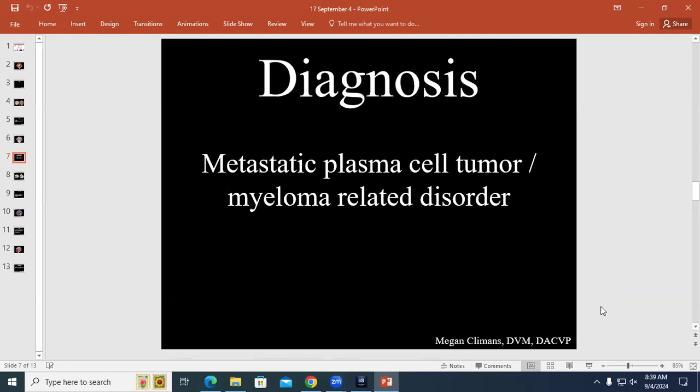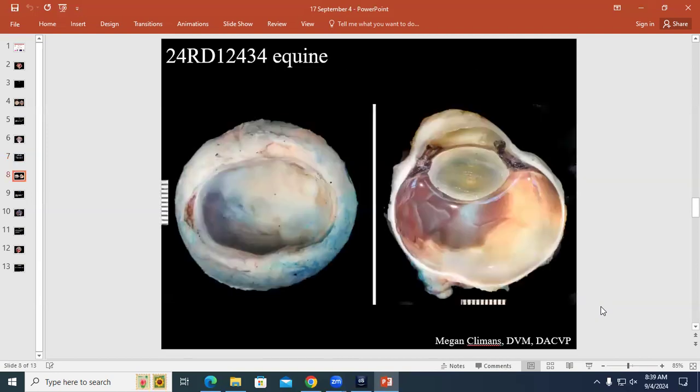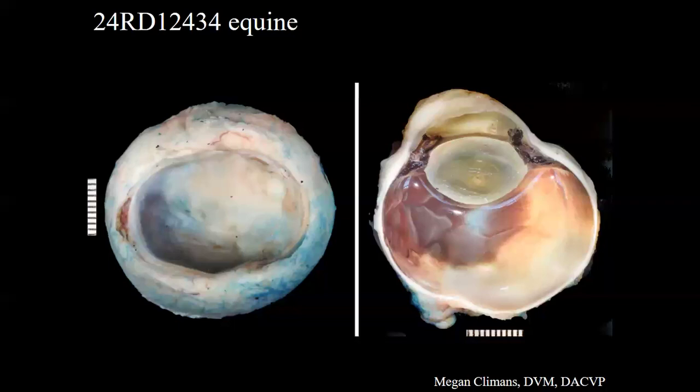Maybe clustering along surfaces. Let's go on. Okay, we'll do the next one. Sorry. No, you should ask these questions. These are interesting discussions. No apologies needed.